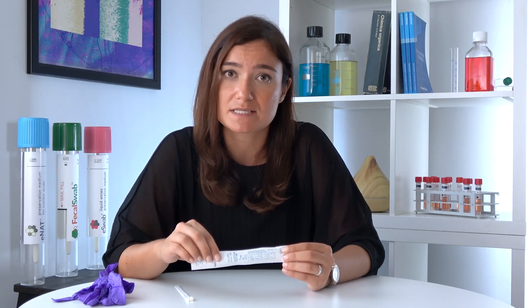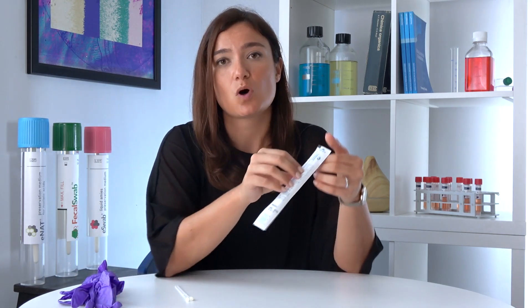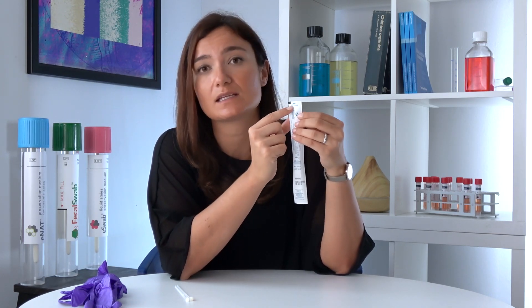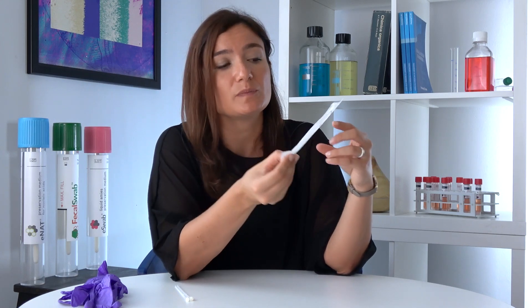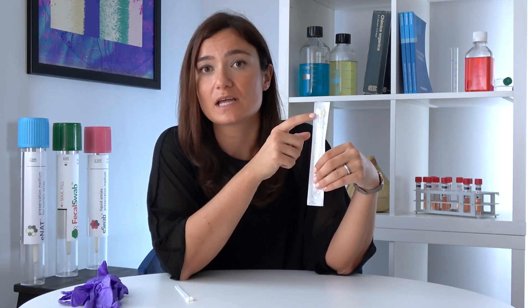Now let me explain how you can use our medical devices and swabs in a way that does not compromise their sterilization. Let's pretend for a second you're a healthcare professional about to perform a test using one of our swabs. First of all, it is important that you wash and disinfect your hands and wear single-use gloves. Once you're ready, you can handle the swab — make sure that you peel the external pouch from the correct side indicated by the arrow. This is important because if you peel it from the other side, you risk touching the tip of the swab and contaminating the final result of the diagnostic test.